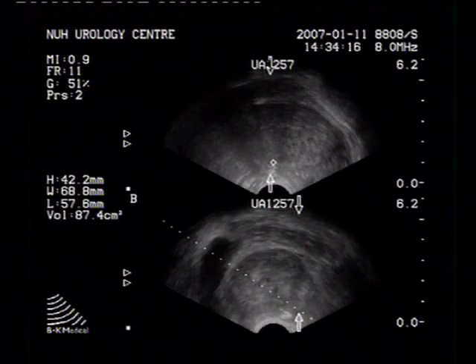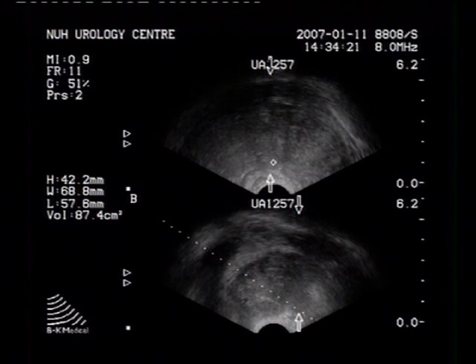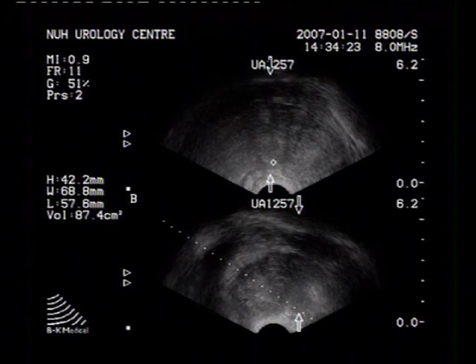We then proceed to systematic biopsy of the prostate using an automatic spring-loaded biopsy gun with an 18-gauge Tru-cut biopsy needle.